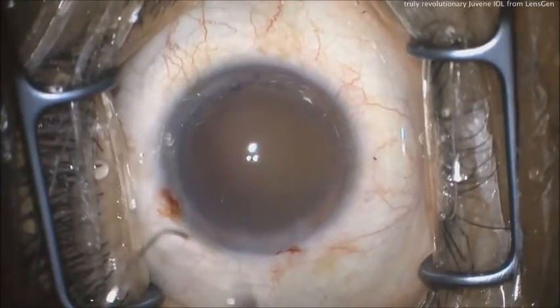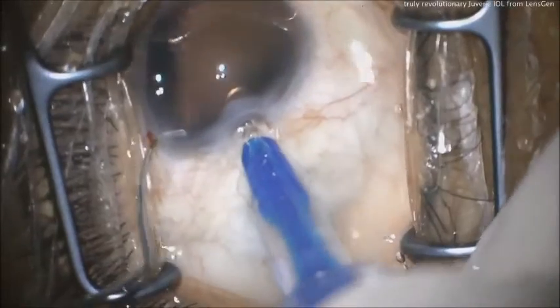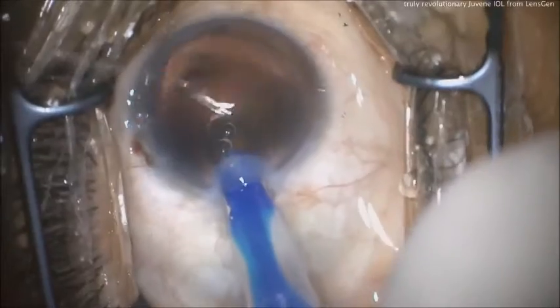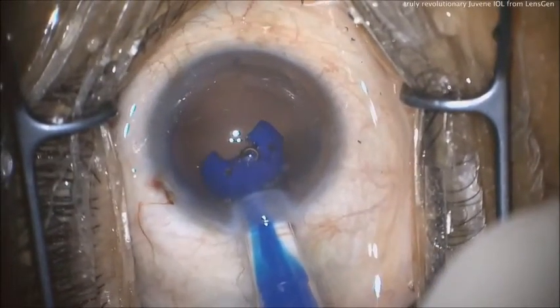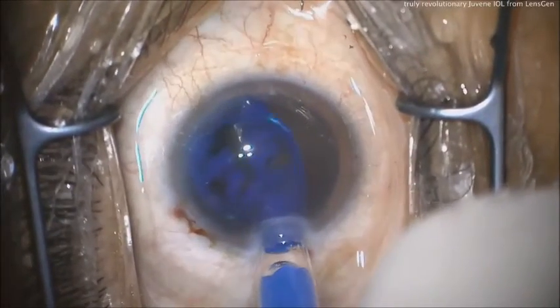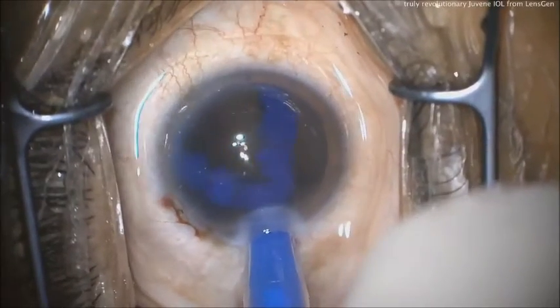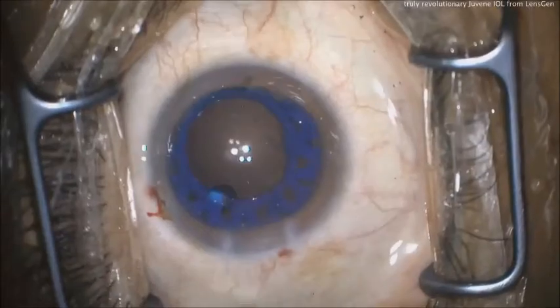Here's the end of the case. The lens has gone through almost 10 iterations, and this company was started on the back of a napkin 10 years ago. Here comes the base lens going into the capsule bag — you'll see it fills the capsule bag completely. It doesn't shoot out; it comes out very controlled, and we just deliver the entire thing in one motion. It goes right into the capsule bag with no more manipulation needed.